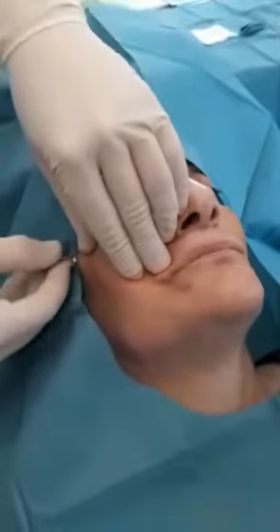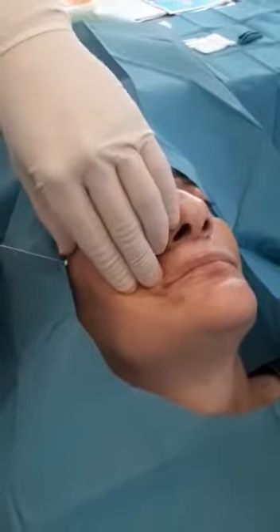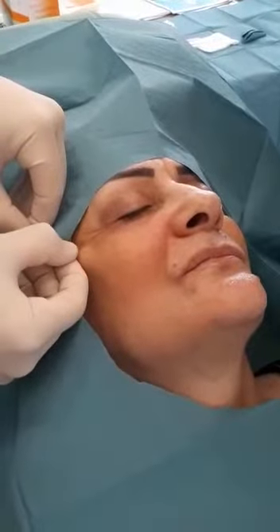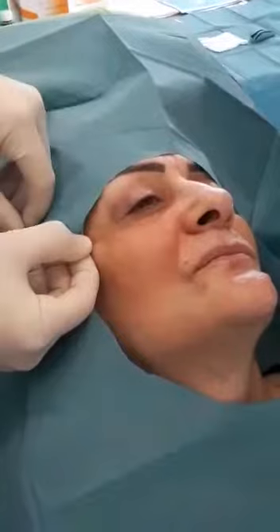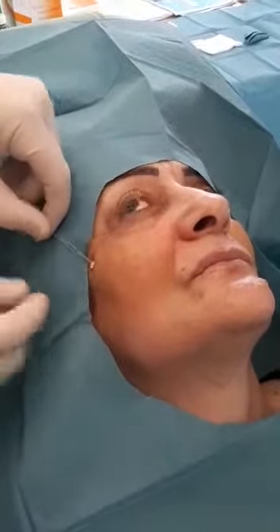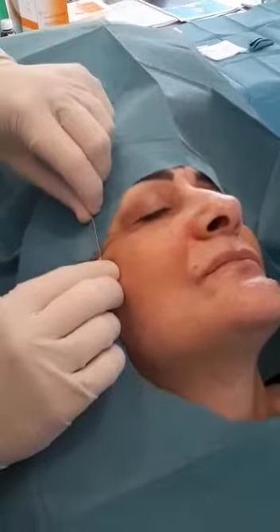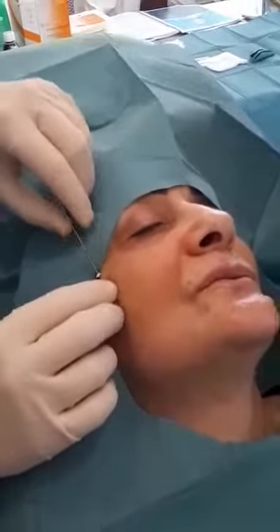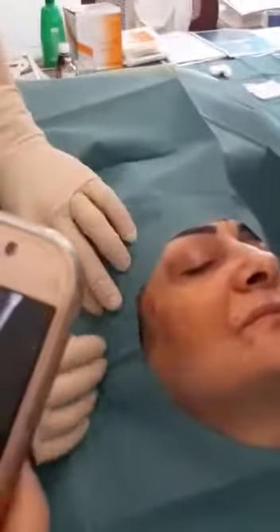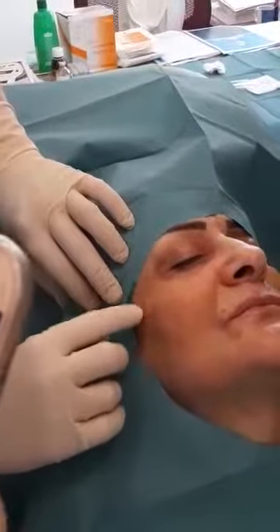Do a curved line. Yes. See how it works. Okay. I'm going to check all the parts there. Everything is okay, madam? And then you just bury the tail of the thread in the tissue in order to have fixation. Okay? Then you check. There is a little tail over there.